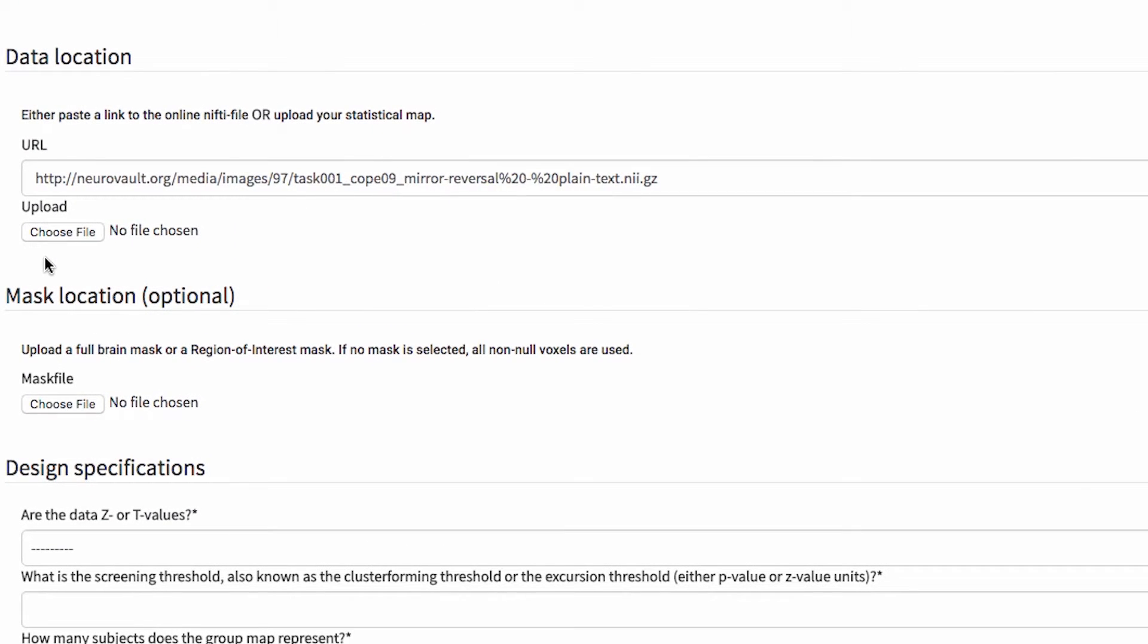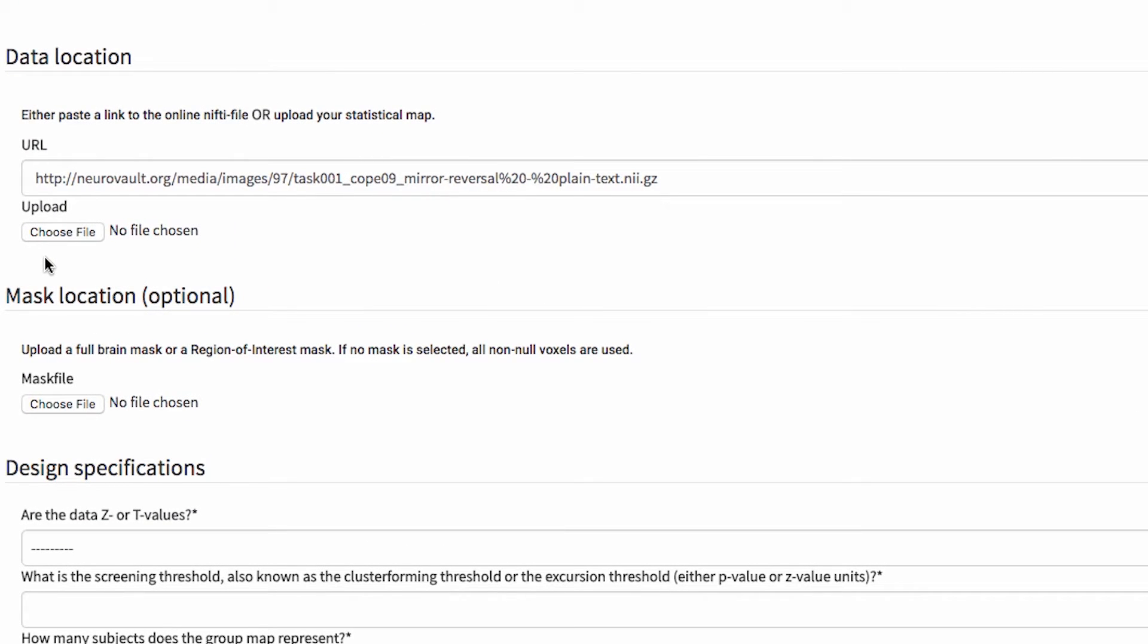If you have pilot data of your own, say a group-level map from SPM, or AFNI, or FSL, anything that's in nifty format, you can upload it using this command right here. Also, if you have a region of interest that you're restricting your analyses to, you can also upload that mask right here with this file.